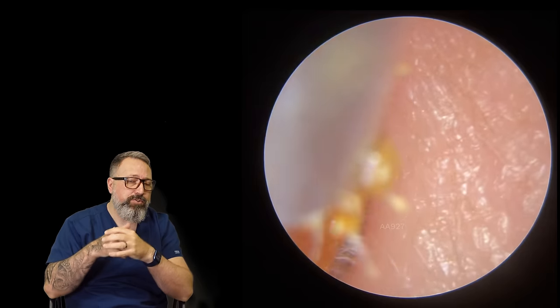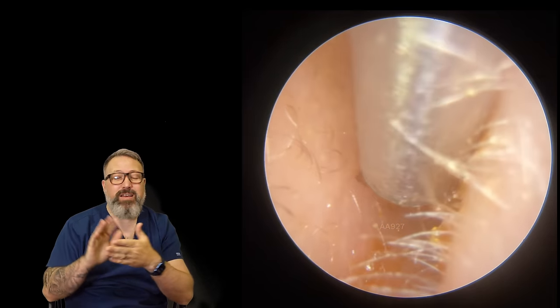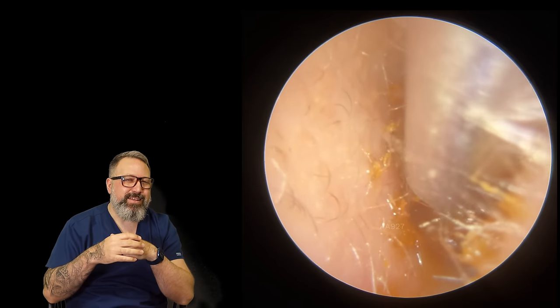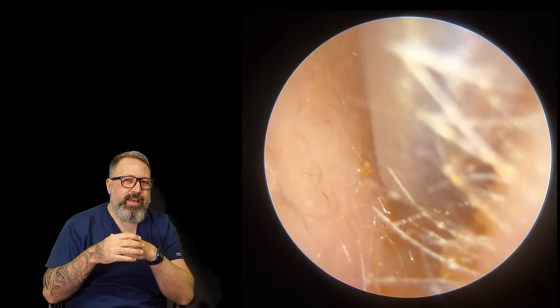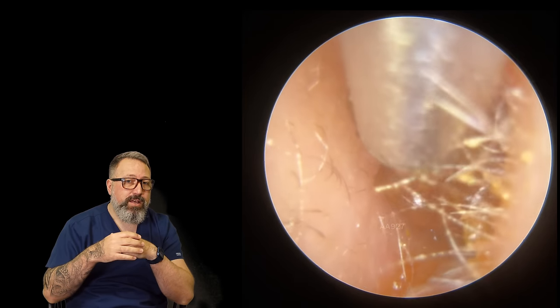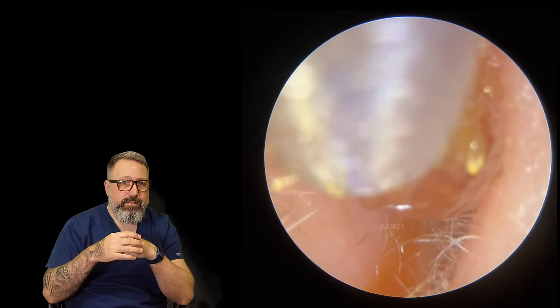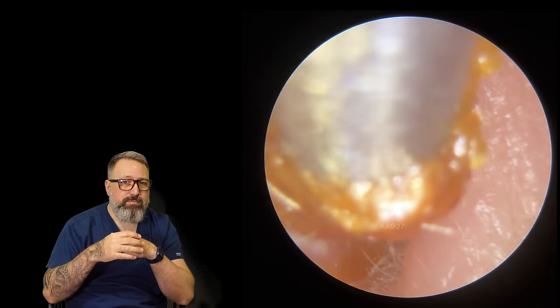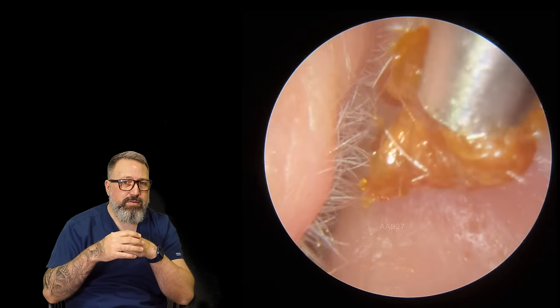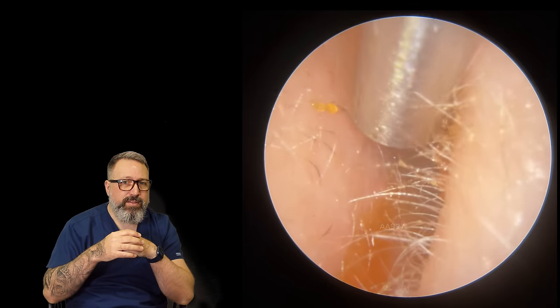It's not unusual to get mixtures or different layers of debris in a plug, which is what's happening here. This looks like a little bit more wax - we're just going to pull this down, working right at the entrance to the canal here. There we go, out that comes - all the way out. Looking lovely. And let's take a look beyond that - is there anything left in here? Yes, there's a little bit more of the plug - you can just see at the entrance.